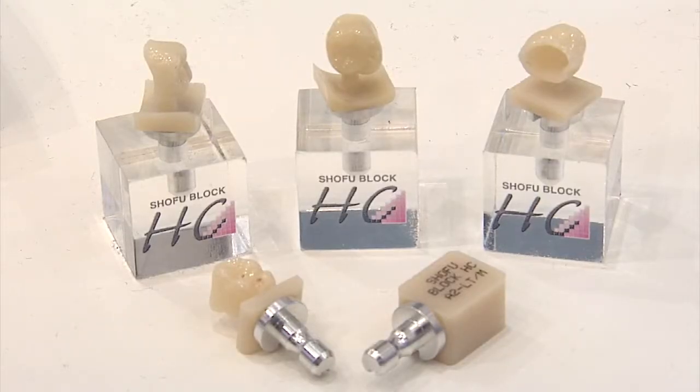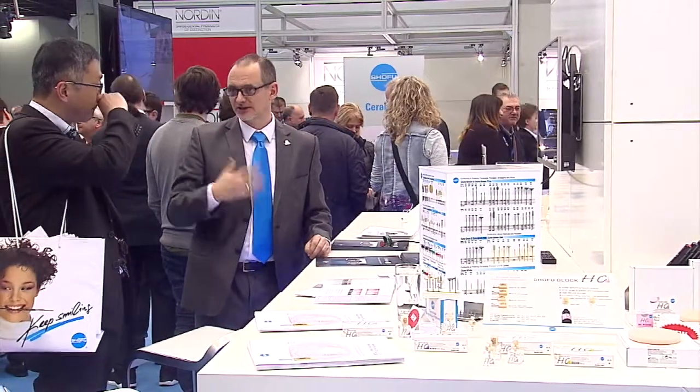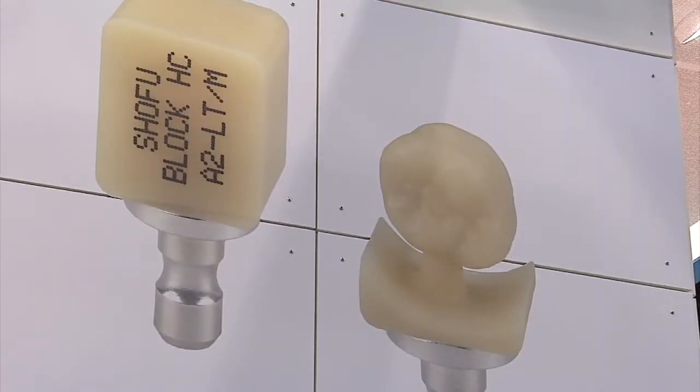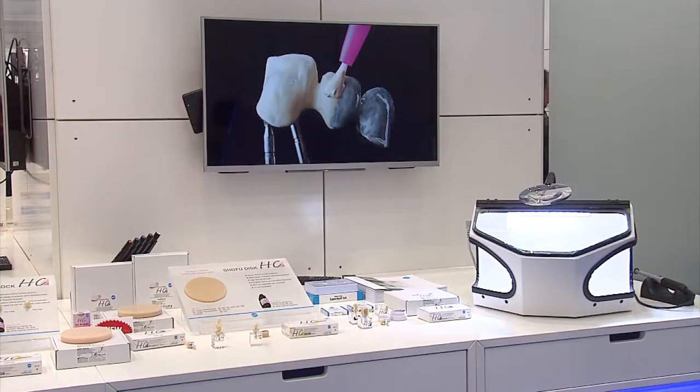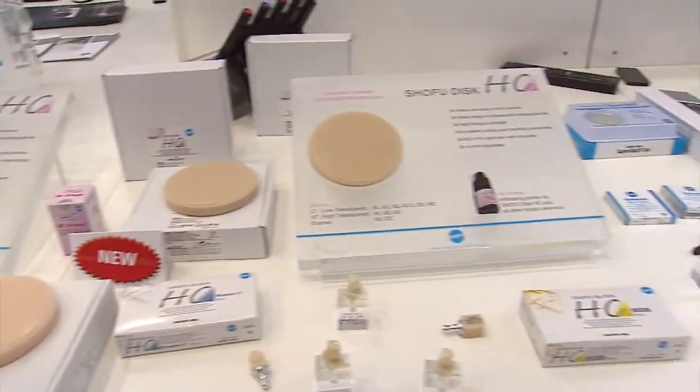What I like most is the fact that it is now available as a brand new multi-layered version. So you have enamel and dentin — a really nice transition that offers high aesthetic potential.